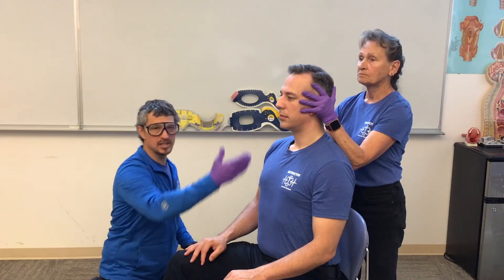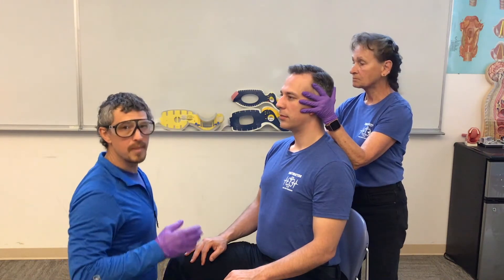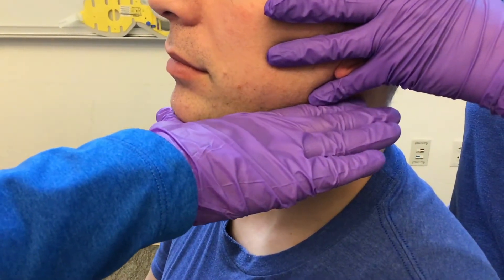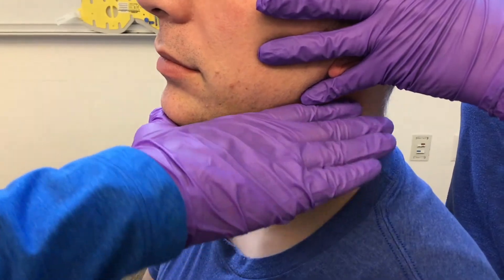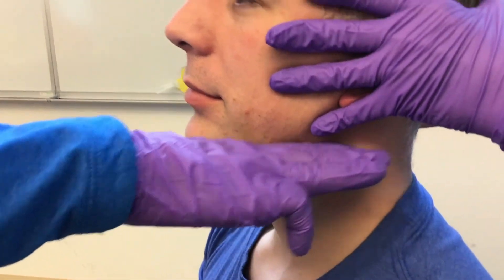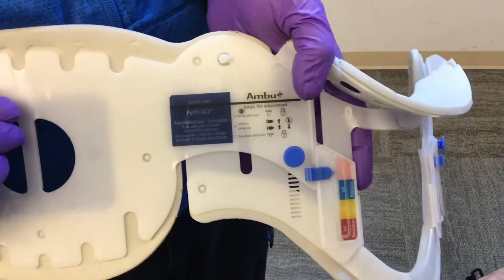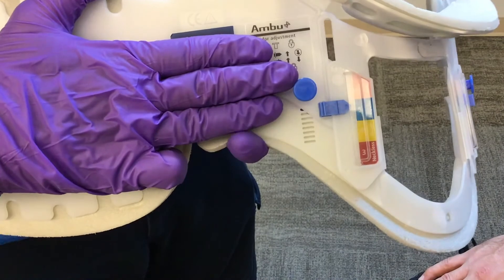Now that I have my patient sitting nice and tall, I can see that he's neutral inline. I'm going to measure for my collar. I'm going to make an L with my hand, come in straight so that my thumb rests right below his chin, then I'll drop my fingers down to the top of his trapezius. I'll take that measurement from where my fingers hit his trapezius and measure again from the top of the black line to where the plastic will meet his trapezius. He has about three of my fingers, then I'll lock my collar in place.